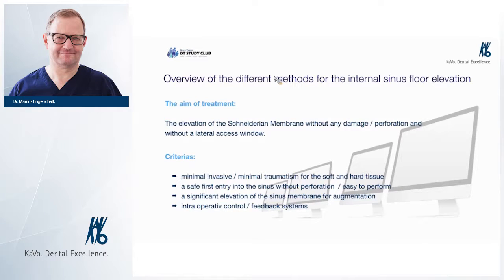If you transfer this cone beam data into a surgical planning software, then you can position the implants right before you do the real operation. Now you can position the implants, you can plan the implants, and you can see how much bone I need.